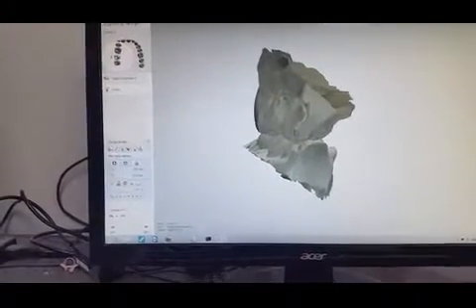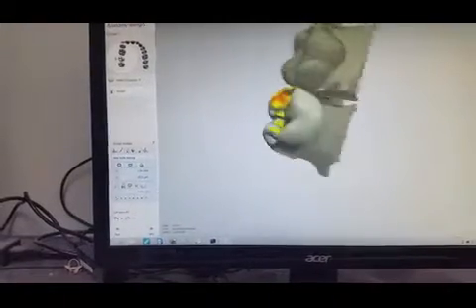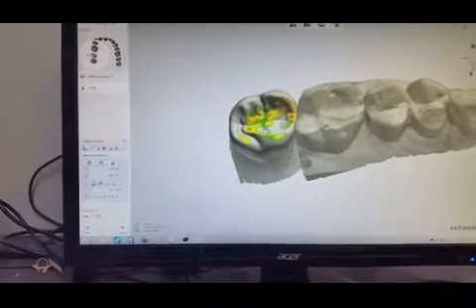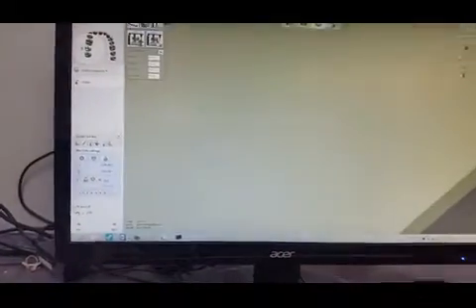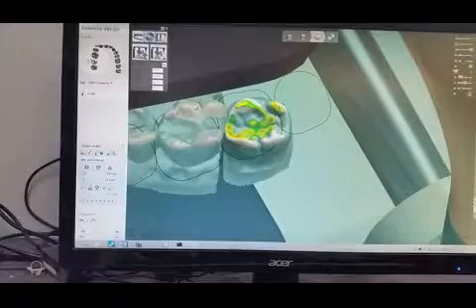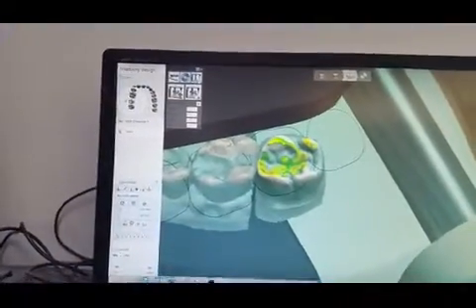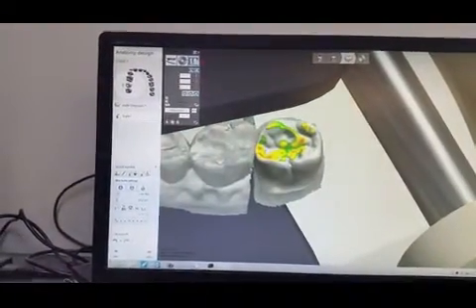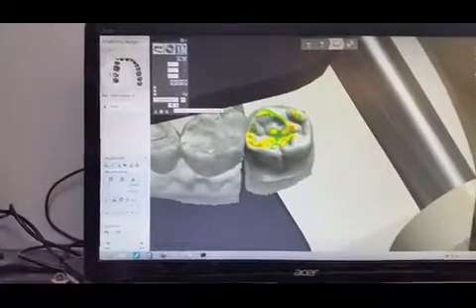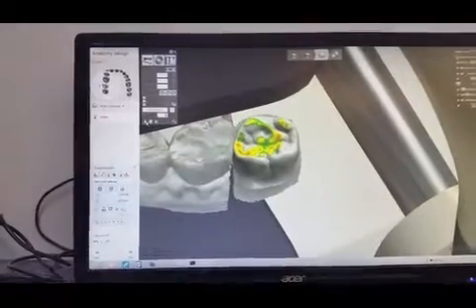And we look at this angle to make sure the crown is in line with the rest of the teeth. And looks like everything is in line. Before I proceed to the next step, I'd like to do the excursion movement, which I put the case on an articulator, and we have the system go in lateral movement to make sure we're not hitting.